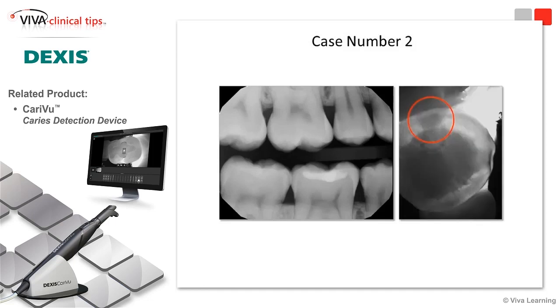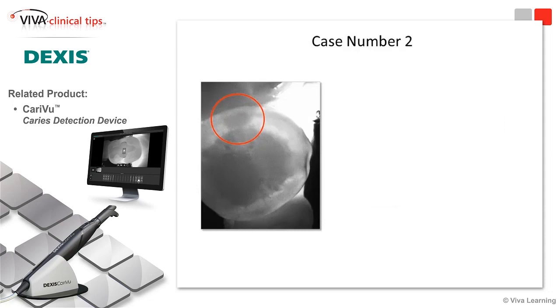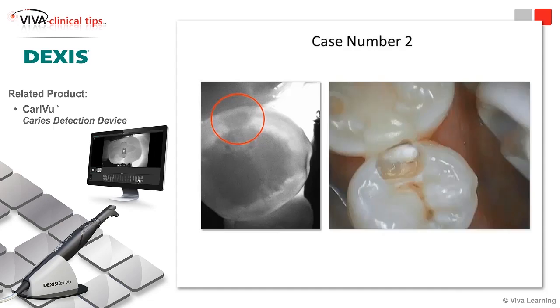On the right-hand side, we have the CarryView picture that shows me where the incipient lesion was — it's revealed the lesion at the DEJ. We've got the CarryView here on the left, and the intraoral camera picture on the right, which shows you the decay. What you see on the CarryView is what you get. It's really impressive.